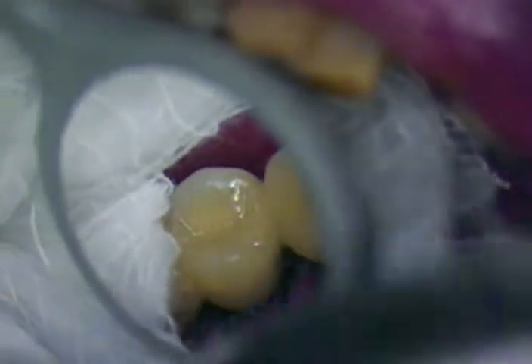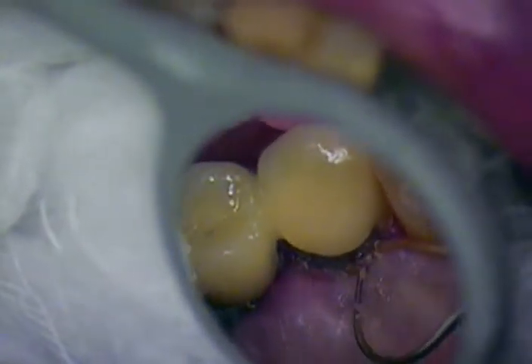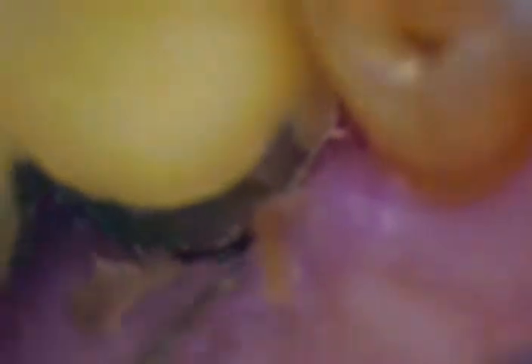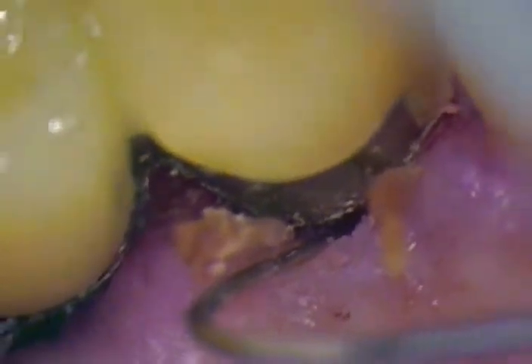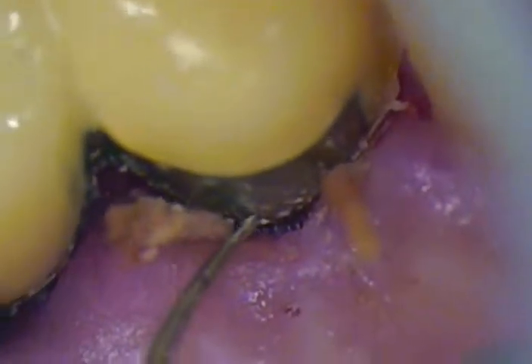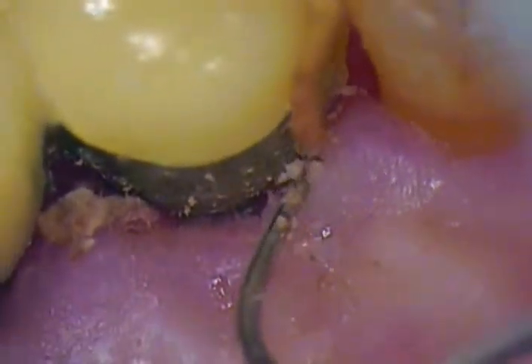It should be a relatively easy cleanup when you think about it — you've done everything right. In this case I didn't even go to a bisque try-in; I went right to a finish from a metal framework try-in. At the metal framework try-in I like to check the abutments as well. Let's show the audience how that lingual margin looks — zooming in on the lingual. This area underneath here — this is the tissue we want to protect. Here's the margin; you can't even feel it. So you've got your bridge all the way down and then there's the abutment. This soft tissue prevents the cement from going down into that no-zone and creating any peri-implantitis.